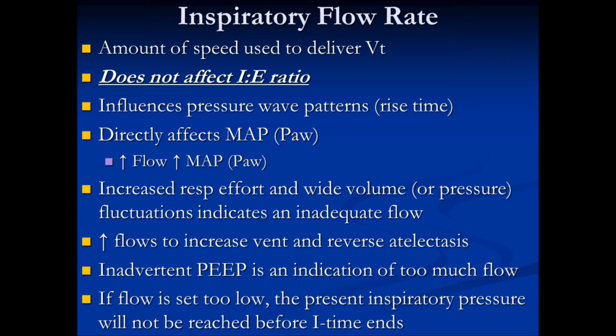It shows the flow rate form, pressure over time.